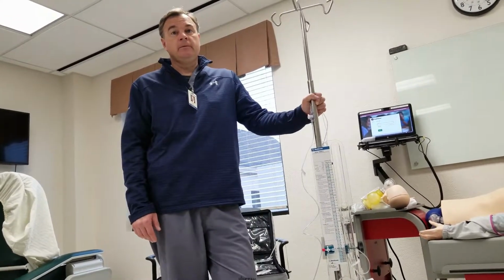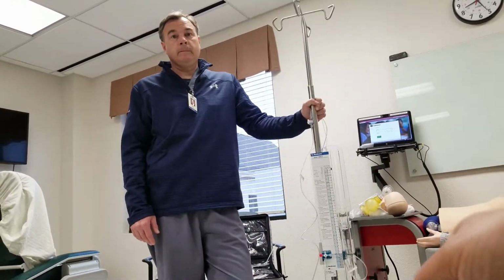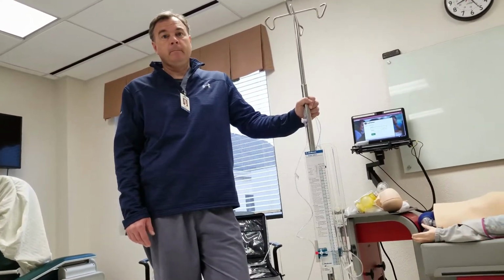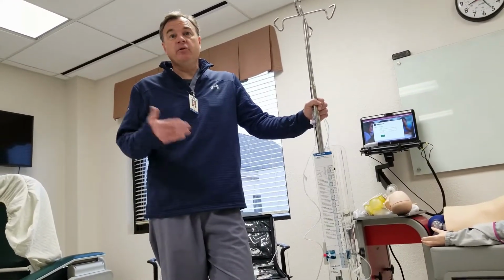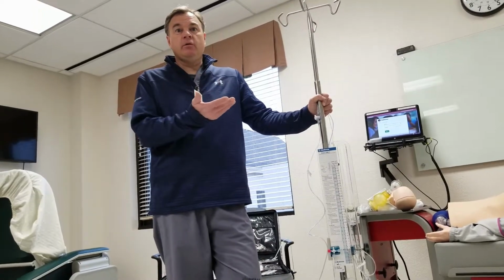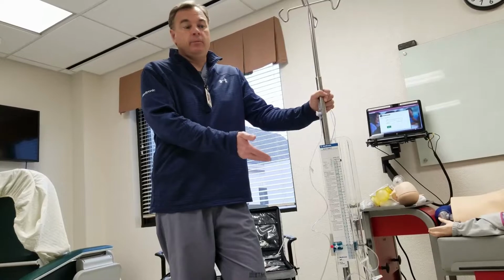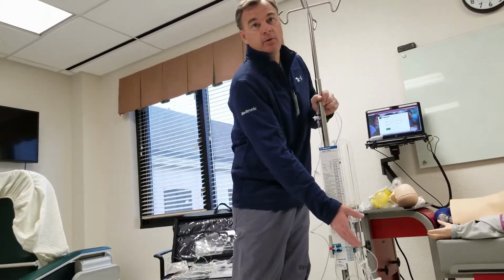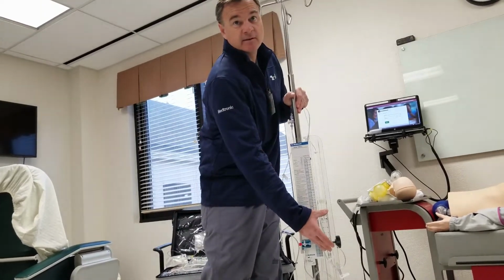So for example, on that one time when we have 11 cc, I will drain it to the bag and then wait again for another hour. However, whatever your interval of charting, that's kind of whatever you're putting in. Every 4 hours, I want to put down how much has been pulled off. Whatever your policy is, this chamber just stays in sync with that, right?